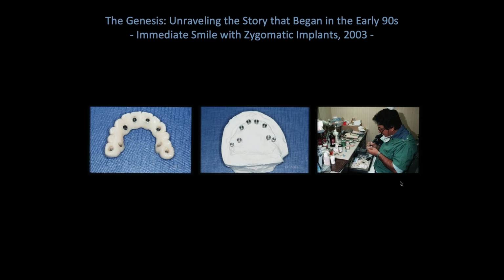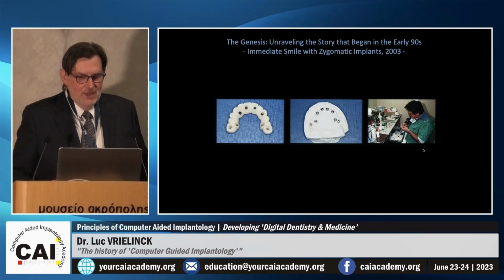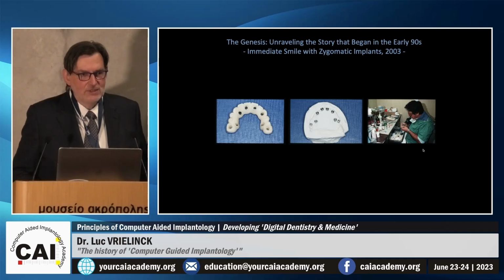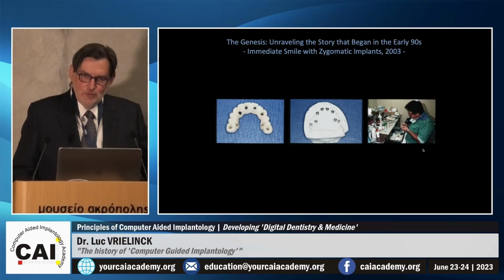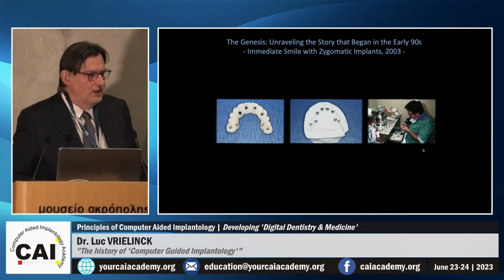And then it was up to the dental technician to work. Remember, it was 2003. We had no digital fancy things like we have today, so it was the manual way. He had to work late in the night because we wanted to put the bridge the next day. And of course, Philippe, you remember, when the technician was working, for us, we went to have a good meal and to relax a little bit while the other people were working.